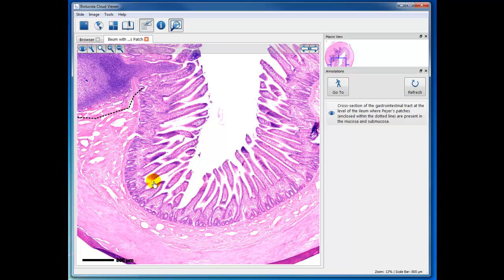There isn't a whole lot more to say. What we expect is for you to be able to identify small intestine versus colon versus stomach versus duodenum versus esophagus. Okay, so I'm going to leave this specimen and go on to the next one in a moment.